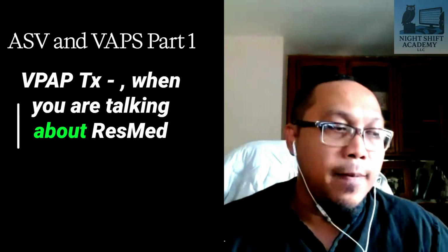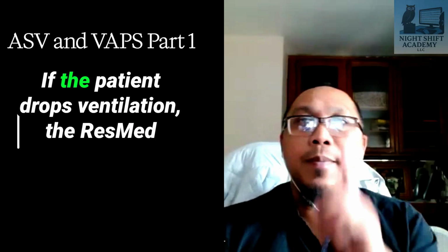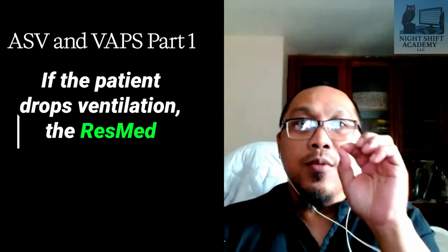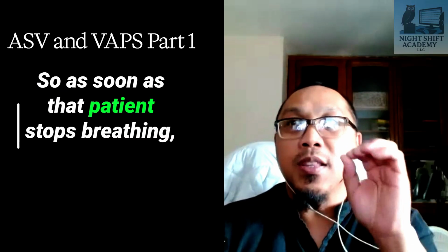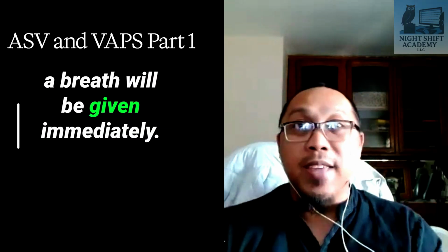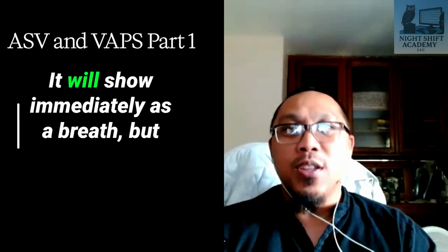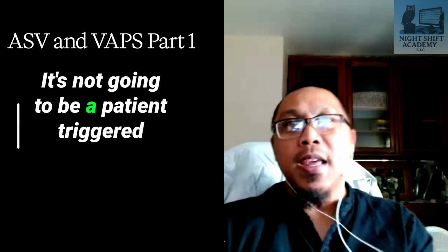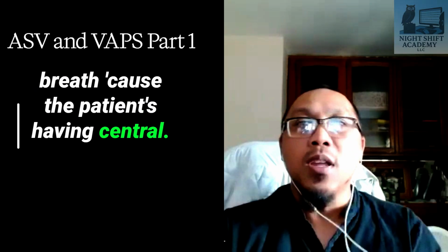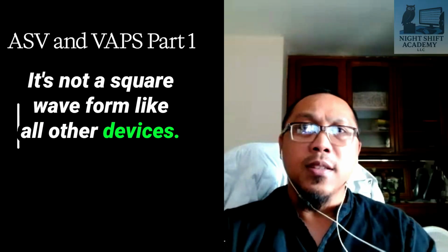When you're talking about the ResMed algorithm, it will not wait, not even 1 second. If the patient drops ventilation, the ResMed machine will monitor the minute ventilation. So as soon as that patient stops breathing, a breath will be given immediately. You will not even see a 2-second apnea. It will show immediately as a breath, but you will notice it's a machine-triggered breath. It's not going to be a patient-triggered breath because the patient's having central. The waveform of that breath is more of an ocean wave pattern. It's not a square waveform like all other devices.